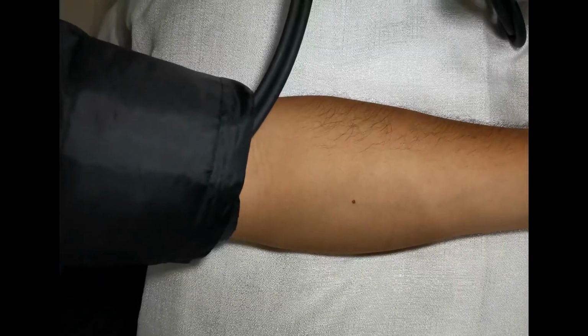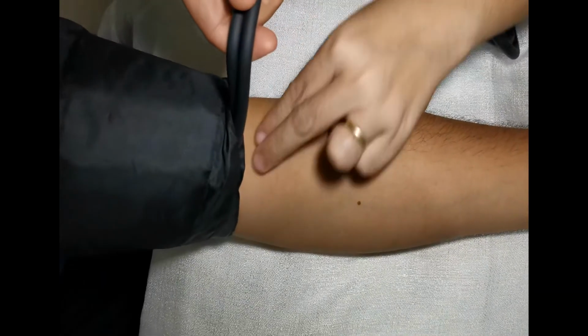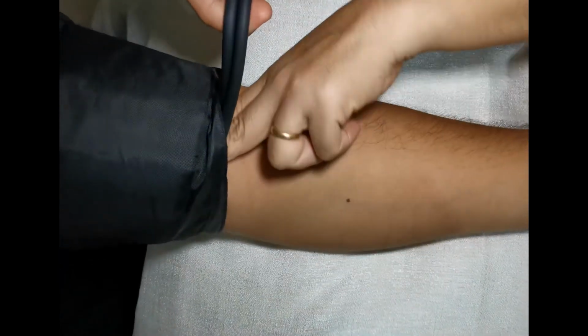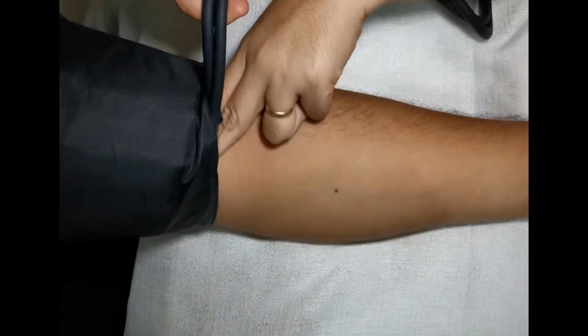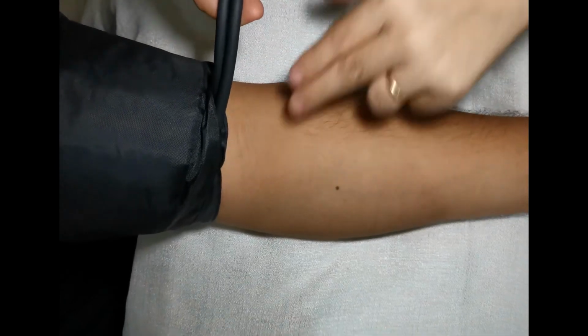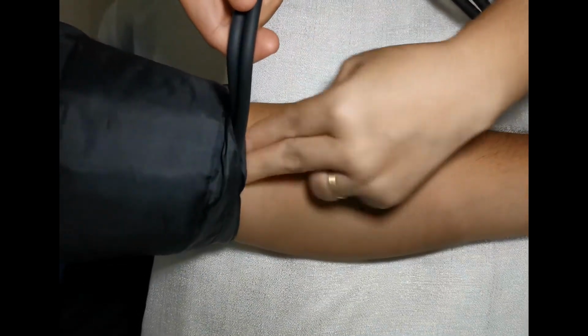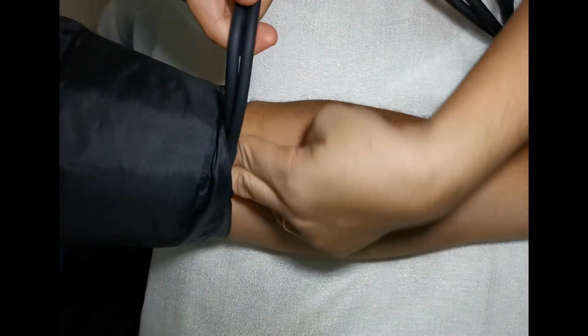You have to make sure that the cuff fits the patient. To check the cuff size, slide your two fingers underneath the cuff and make sure that it's not too tight or too loose. Because if you use a blood pressure cuff that does not fit, you can get an inaccurate reading.